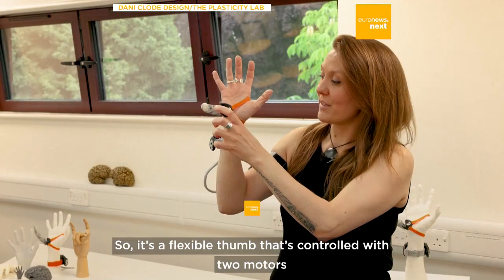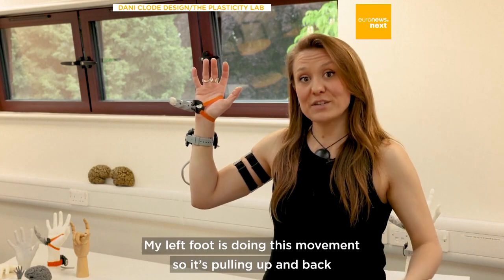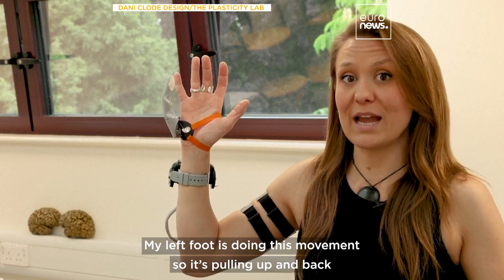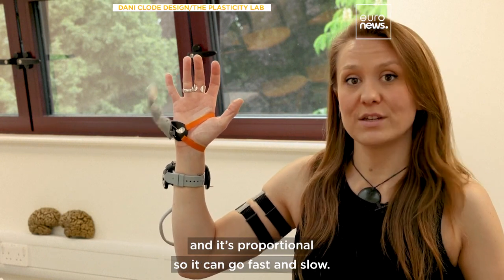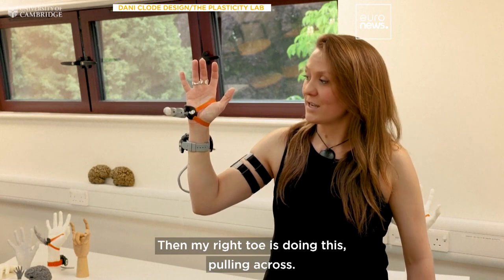It's a flexible thumb controlled with two motors that's worn on the wrist. My left foot is doing this movement — pulling up and back — and it's proportional, so I can go fast or slow. And then my right toe is doing this, pulling across.